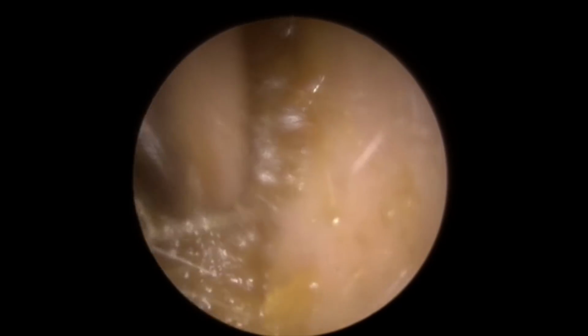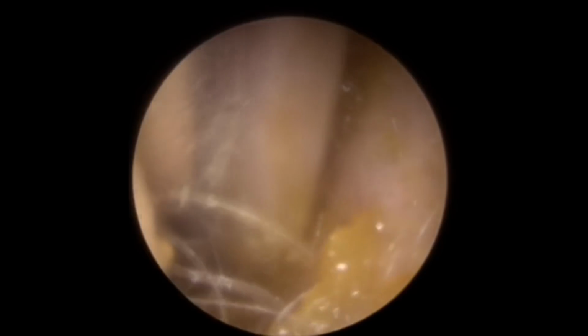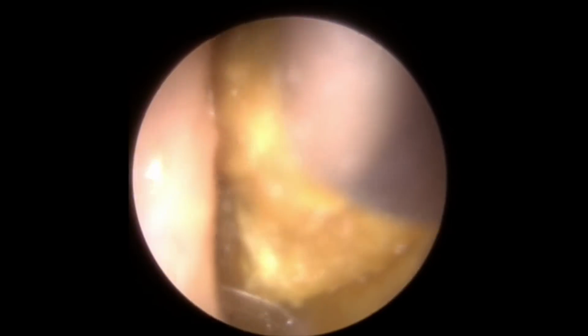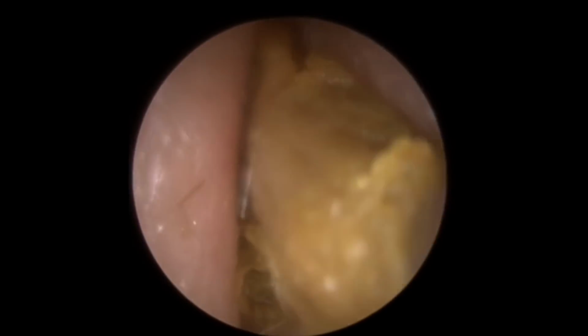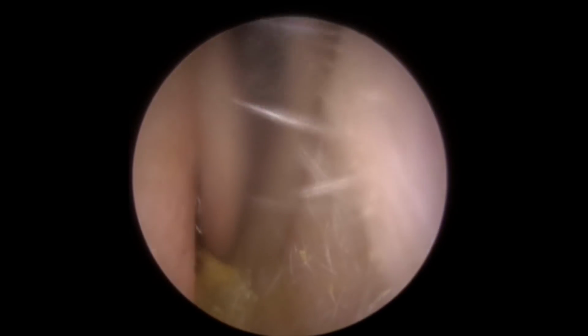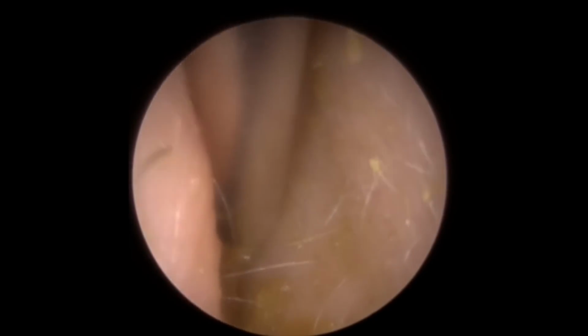Recently had some done abroad using a Jobson horn, and it really caused a few issues in this ear canal. A lot of pain for the patient afterwards. So very nervous patient coming through. Didn't want me to use a Jobson horn at all if I could possibly help it, because he'd had such a bad experience. So we're sticking with the standard size Zollner tube here.